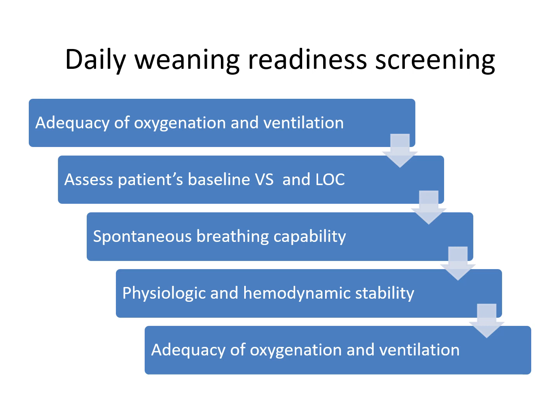So for daily weaning readiness screening, every hospital should have specific weaning and extubating parameters. Typically, you should have an FiO2 around 40% or less. If it's greater than that, then the lung has not healed correctly if it still requires so much FiO2. Also, PEEP of 5 or less. Again, if it's higher than 5, then the patient's lungs are not healed enough. Patients should be able to be awake and have spontaneous respirations.